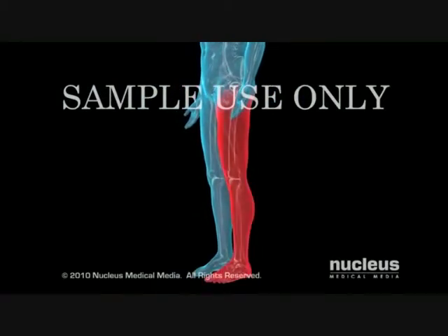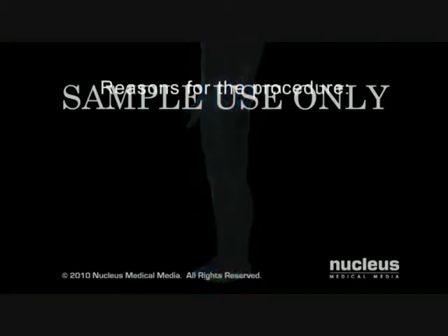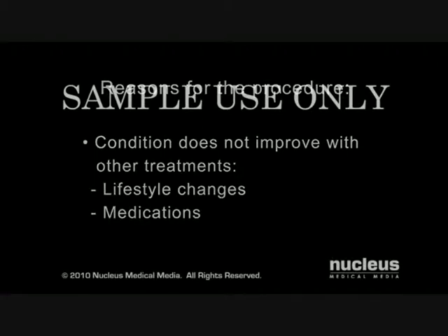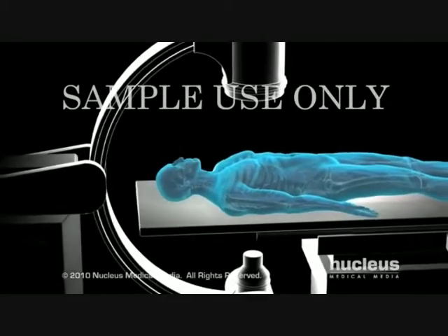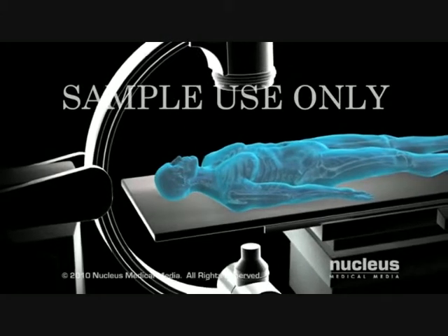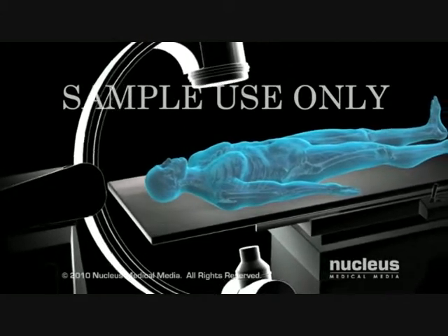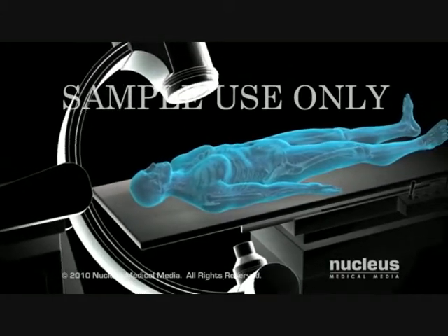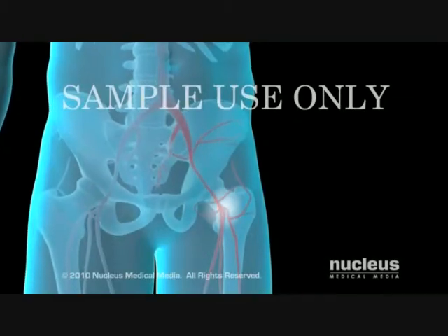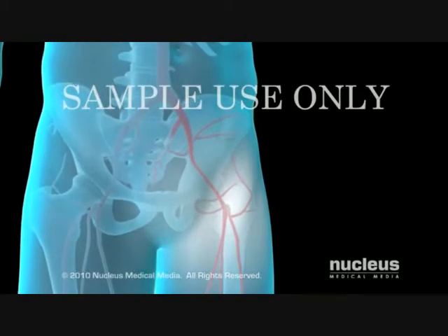A noncardiac percutaneous transluminal angioplasty is only done when your condition has not responded to less invasive treatment options, such as lifestyle changes and medications. To begin the procedure, you'll be placed on a table equipped with a fluoroscope. A fluoroscope is capable of taking X-ray images of many parts of the body from multiple angles. Your doctor will numb your skin around where the catheter is to be inserted.